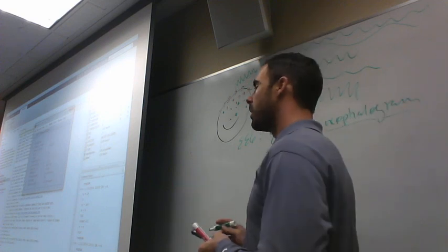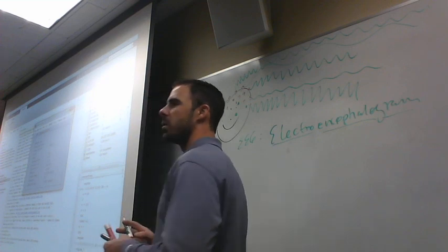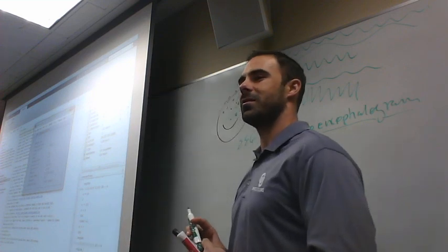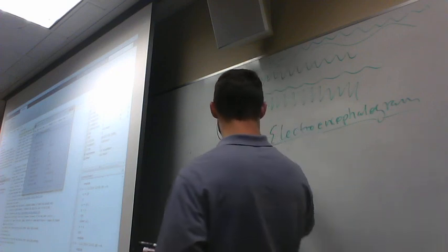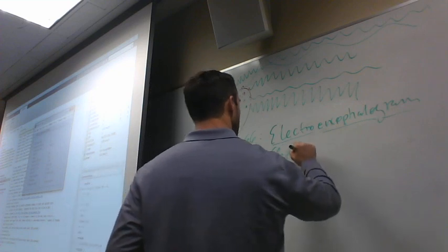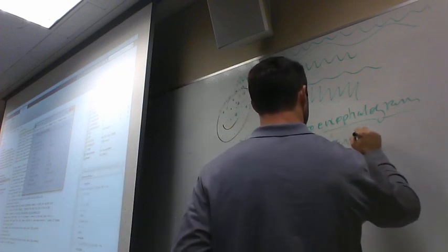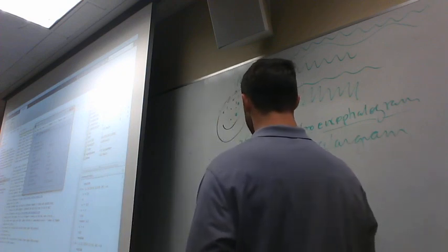Duh. All right? These sites over here that we talked about, these ocular electrodes, we actually call that EOG. What do you think that refers to? Yeah, electrooculogram. So we have EOG, electrooculogram. Okay, obviously we're measuring eye activity there.